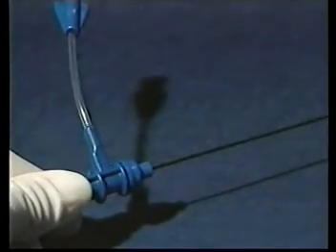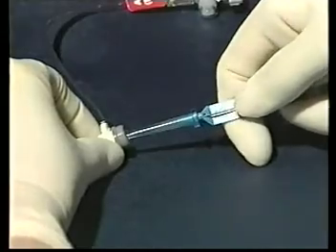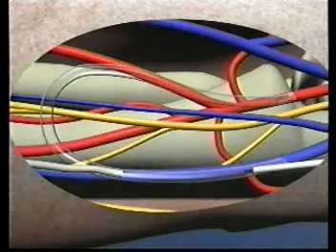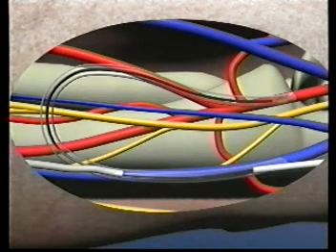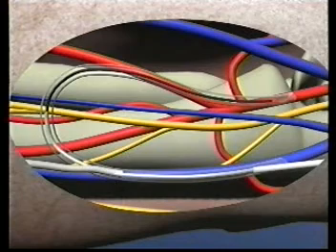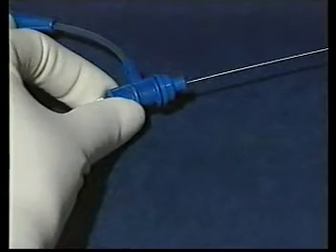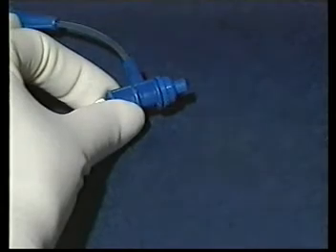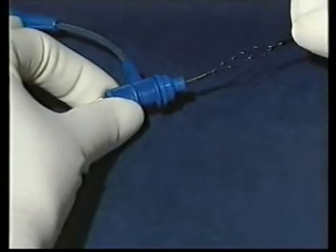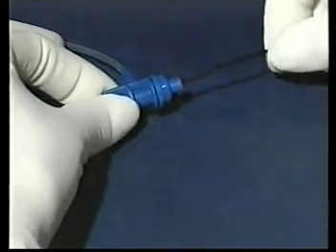In extreme cases, the inner basket and cable assembly can be removed from the catheter and the catheter passed over a guide wire to the desired location. Then the inner cable and basket assembly can be replaced through the catheter and the PTD used. The cable should be fed through in small bites to avoid kinking the cable.